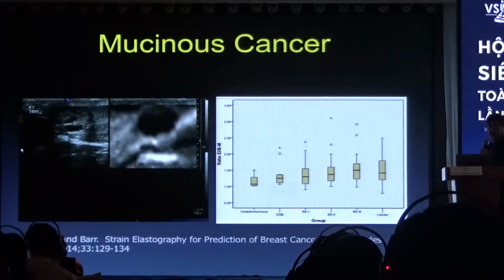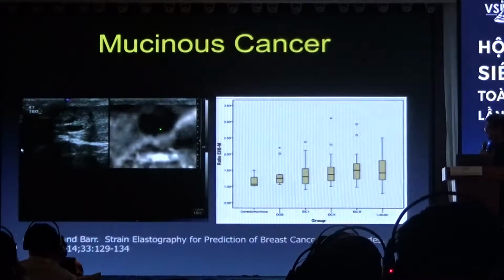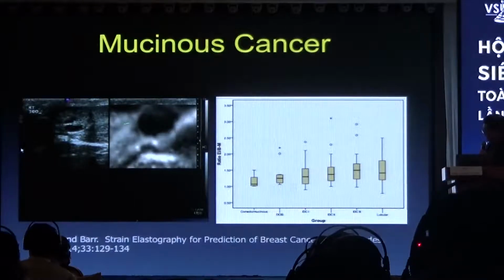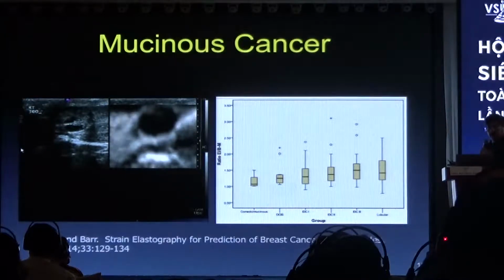And this is another factor that you should realize: sometimes we may see lesions on elastography much better than we do on B-mode imaging, because the lesion is stiffer than the surrounding tissue, but has very similar acoustic properties. And the reverse is also true.